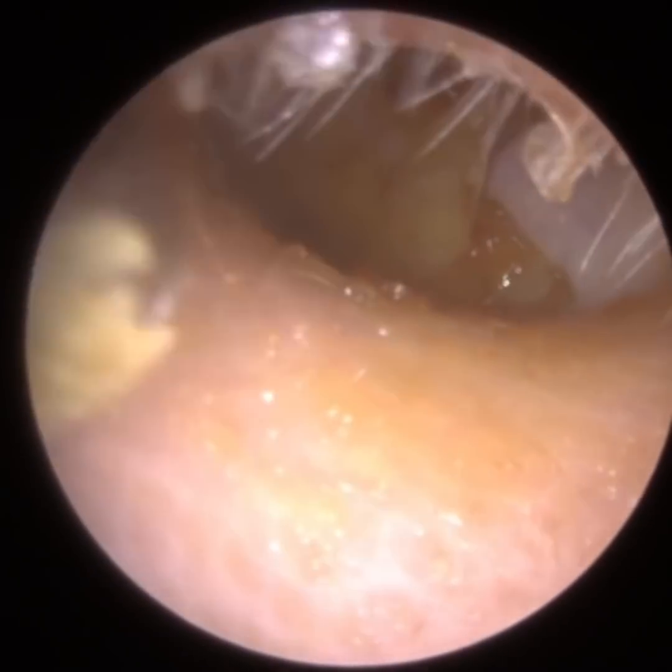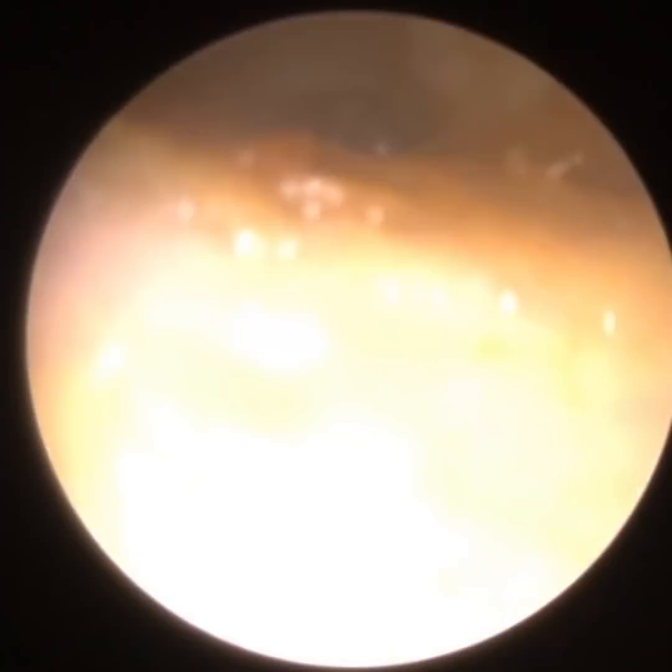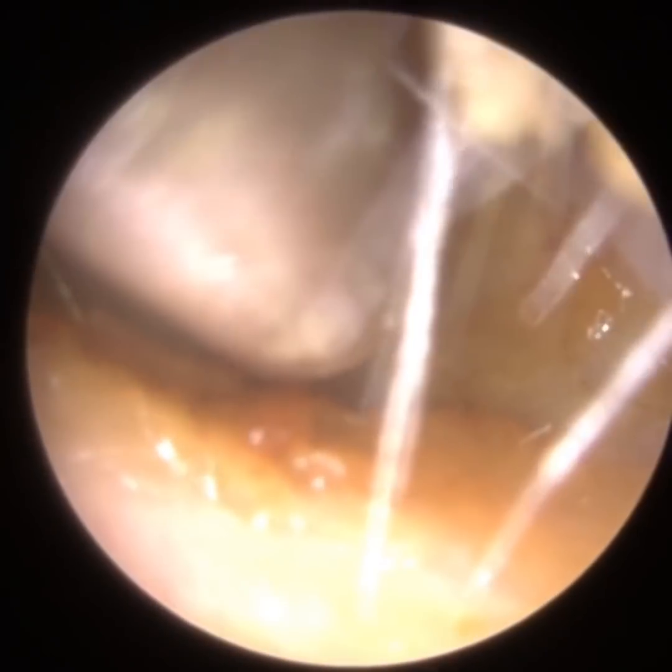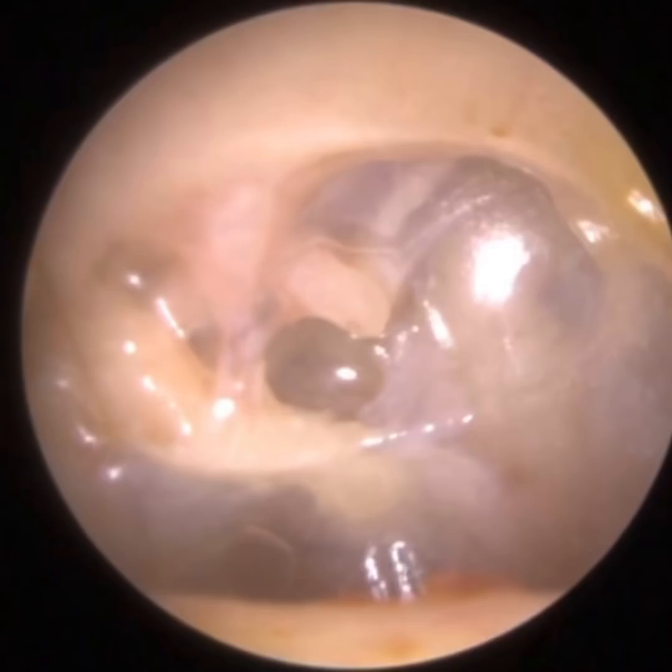You'll see in a moment — I'm taking a screenshot of the patient's eardrum. The eardrum is really retracted. Superiorly, at the top of the eardrum, we can actually see the neck of the malleus, the hammer bone, which means the patient has what we call an auto-atticotomy. The bone at the top of the eardrum — the superior bone — is slightly eroding because the eardrum is wrapped around it and can start eroding the bone. We can also see the incudo-stapedial joint, where the long process of the incus joins the stapes bone. We can also possibly see the chorda tympani, which is the nerve that runs to your tongue from the back of the eardrum. And we can also possibly see the posterior crus of the stapes — the stapes is the stirrup bone, the smallest bone in the body. You get the head of the stapes, then the neck, and an anterior crus and a posterior crus. The bone to the right could be the posterior crus, but it may not be.